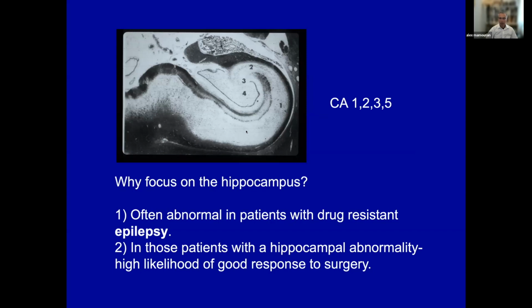And if you identify an abnormality in the hippocampus, in a sense, if we can find and localize an epileptogenic focus to the hippocampus, there is a high likelihood that that patient will respond to surgical treatment. And that is, for these patients, life-changing.